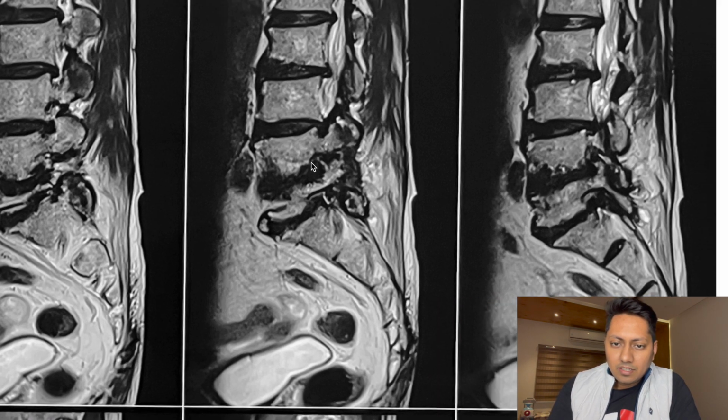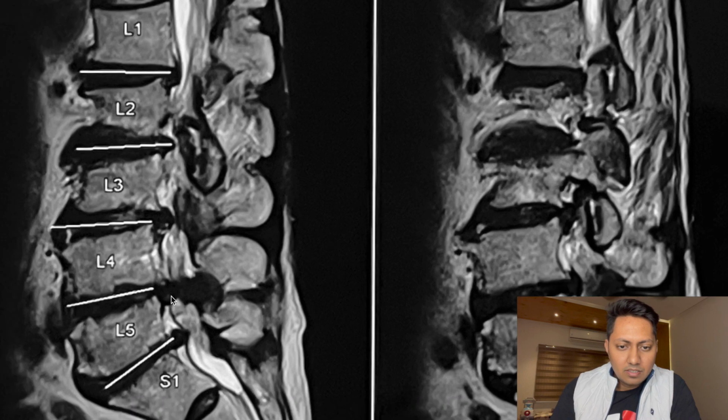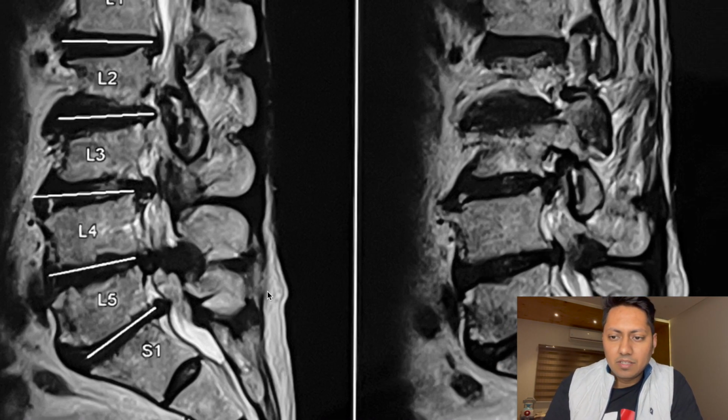Also you can see that there is a bulging disc which is compressing the traversing root. We will see now. You can see over here that this traversing root is compressed by this bulging disc as well as ligamentum flavum hypertrophy from the back. So the L4 nerve root is getting compressed as it is exiting, and L5 is getting compressed as it is traversing this disc space.